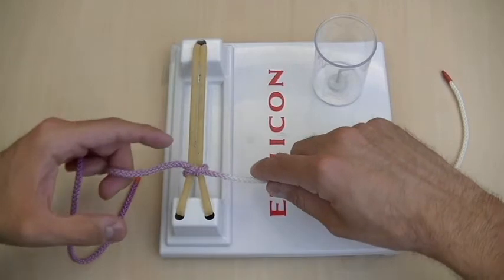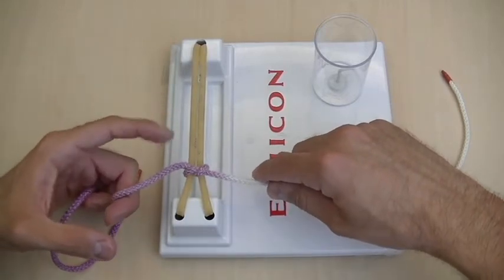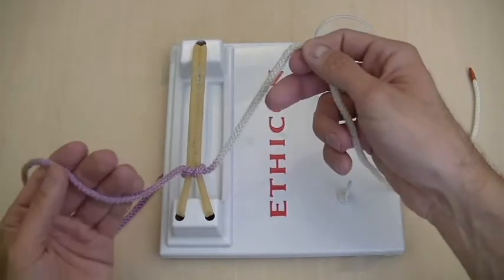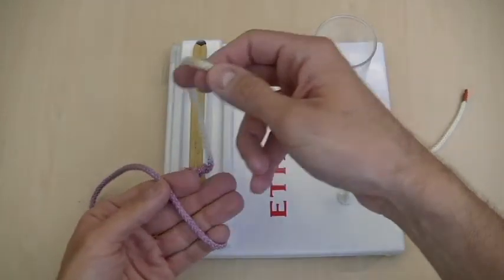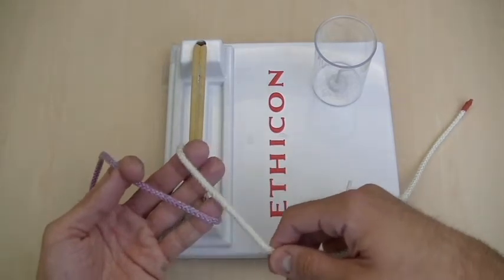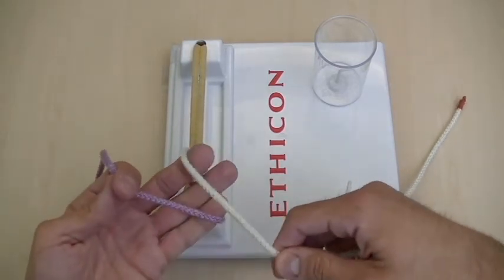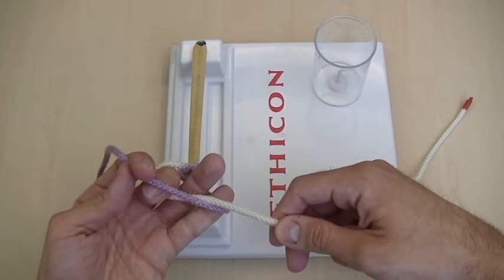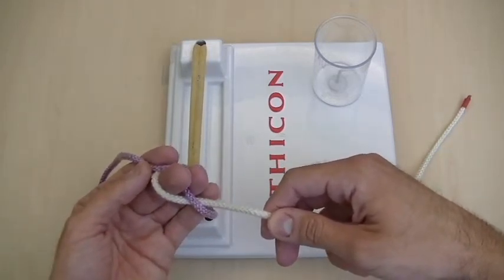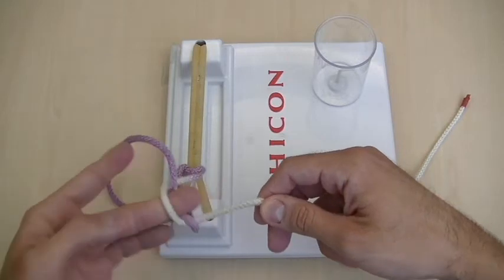Since I did the overhand throw, which is like an index finger throw, next I'm going to do an underhand throw, which is like a thumb. So you grasp right here, bring the suture string over your middle finger. Then the tricky part is you want to use your middle finger to duck this white string under the purple string, and pinch the purple string right here between your middle and ring finger.